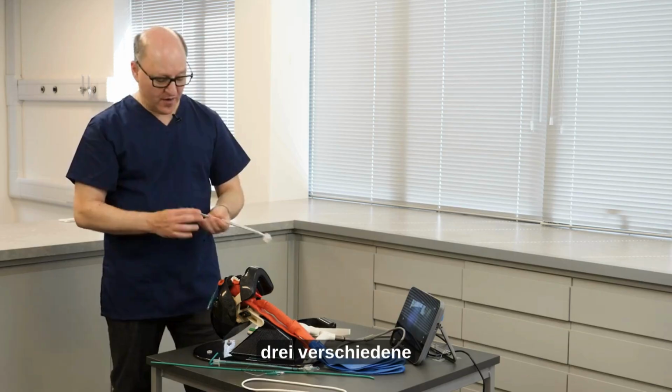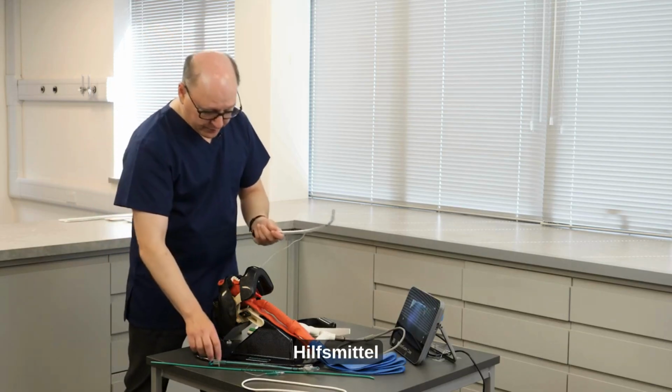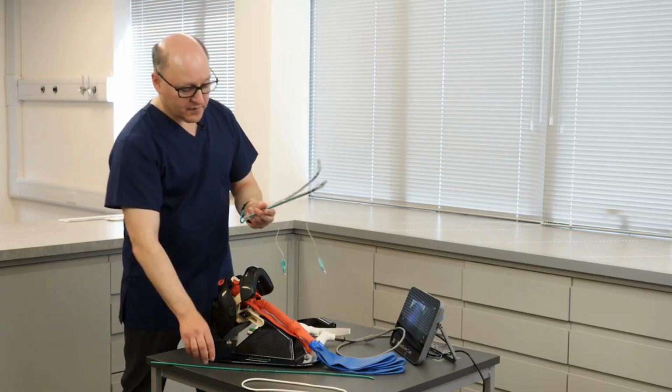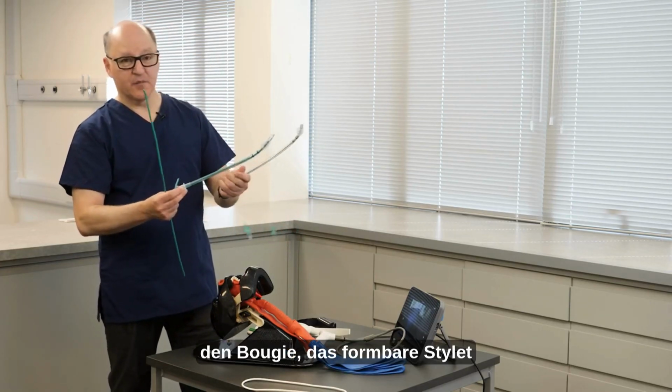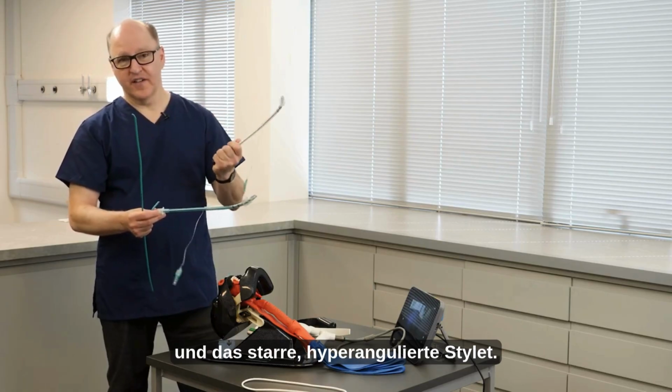So in summary, with the development of direct laryngoscopy, hyperangulated videolaryngoscopy, and with self-contained, conventional shape Macintosh videolaryngoscopy, we have, over the years, acquired 3 different devices to assist with tube delivery: the Bougie, the malleable stylet, and a rigid hyperangulated stylet.